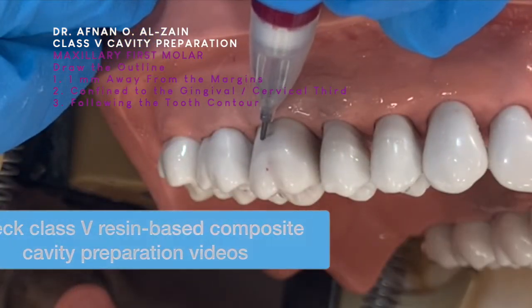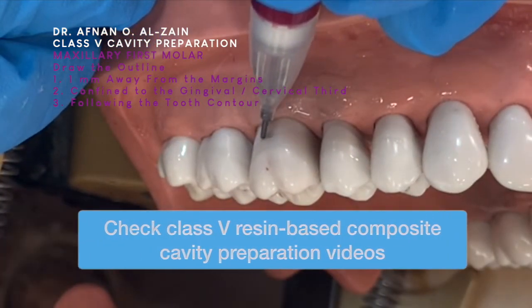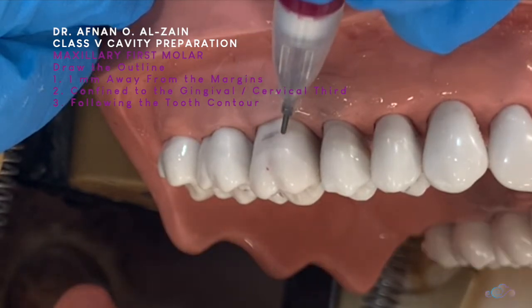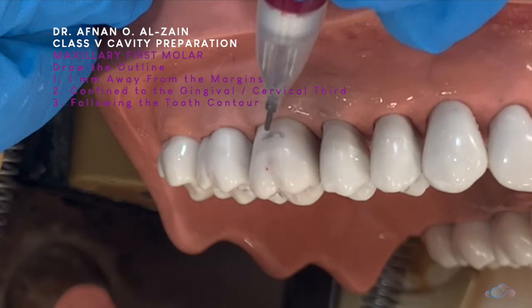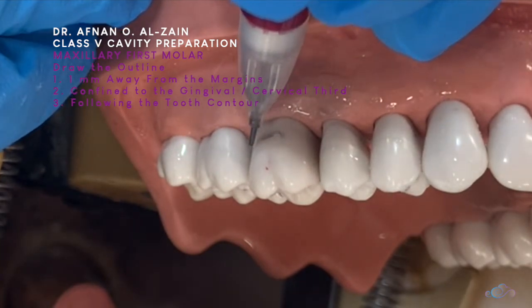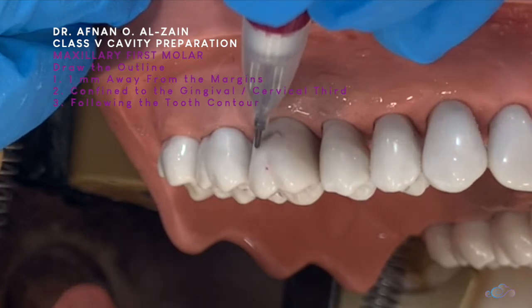We're going to leave one millimeter away from the gingival margin, and one millimeter away from the proximal. Here, because the molar is more broad, the shape of the cavity will be more trapezoid in shape.